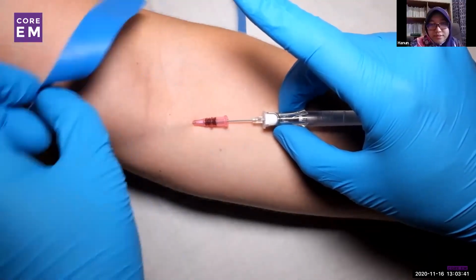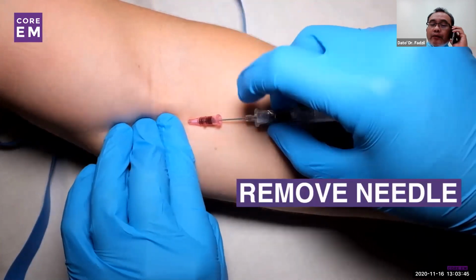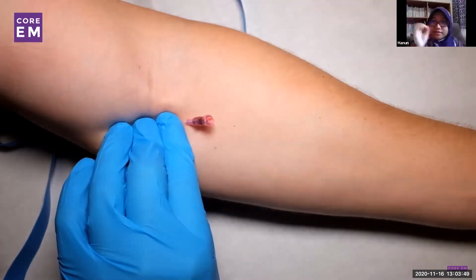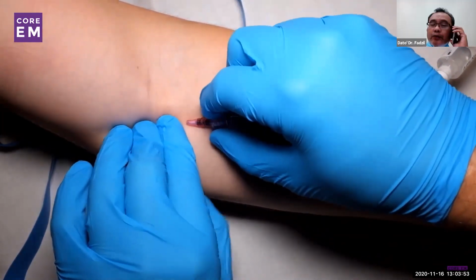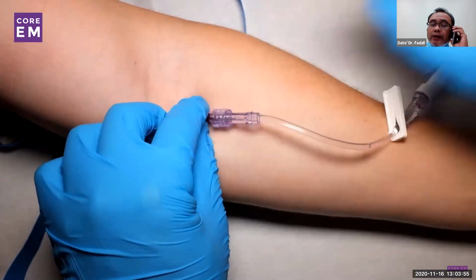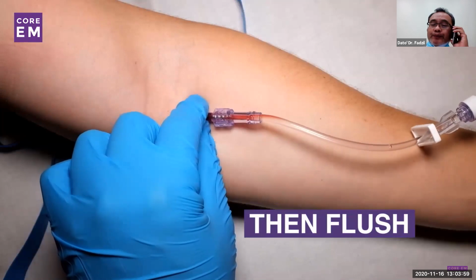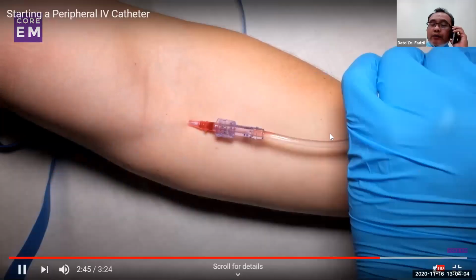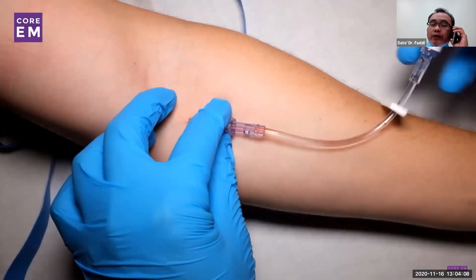And then actually kita... it's like before you pull the needle, before you pull the catheter, remove the tourniquet first, then remove that. Okay. Don't forget to do that. Tapi masa ni kita insert the tube, intravenous tube. Ada problem. And then you aspirate and flush, just to make sure that there is no bubble. Make sure the flow is okay lah.